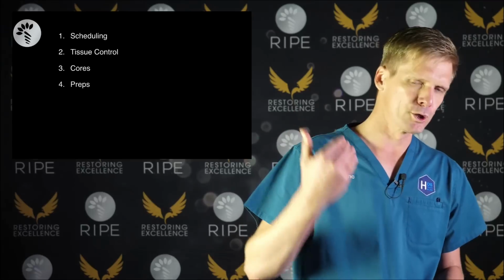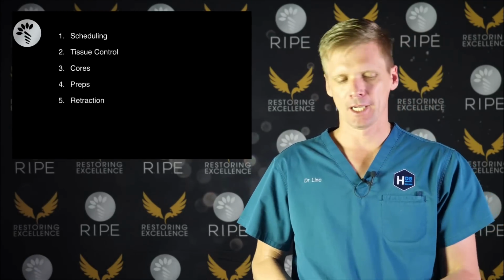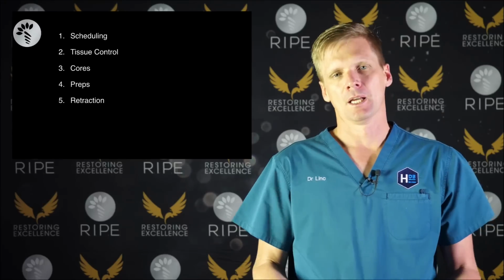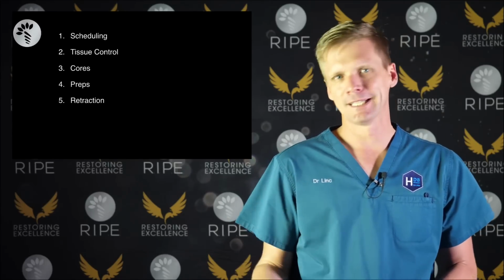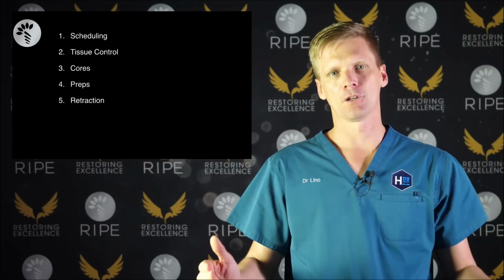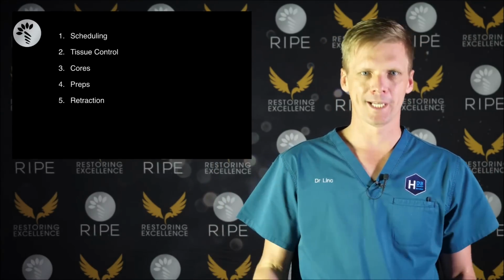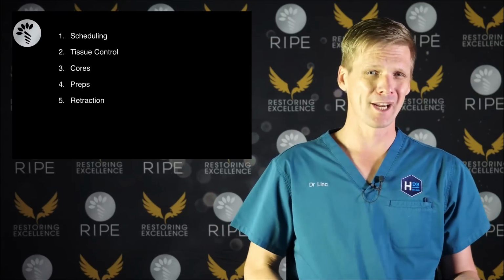Okay, retraction. You can use electrosurge, you can use laser. What I'm really talking about is creating a trough between the gingiva and the tooth that is wide enough, and that's the really important part, wide enough.